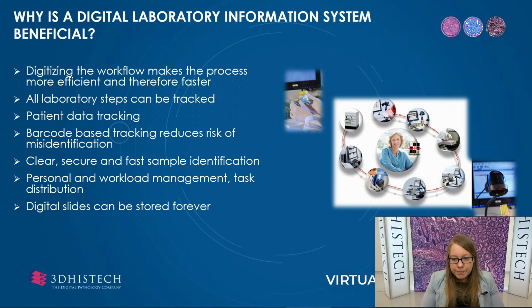Digitizing the workflow makes the process more efficient and therefore faster. Collecting a request, a slide, and a report takes a lot of time in regular pathology. In a digital workflow, these components are automatically linked together. Laboratory steps can be tracked. This is very important when the pathological processing of the sample becomes urgent.